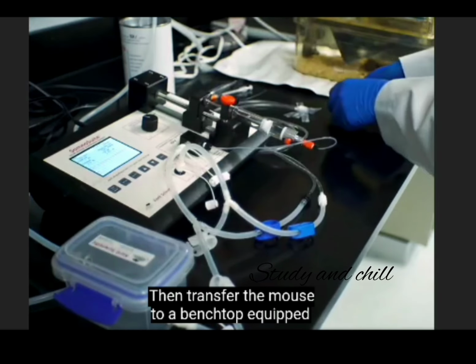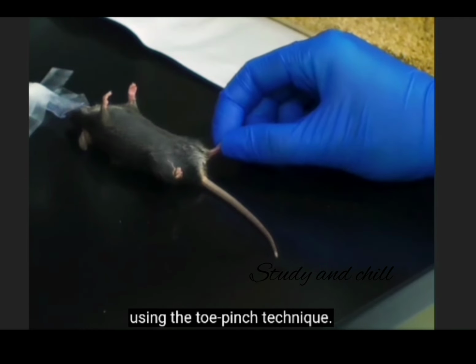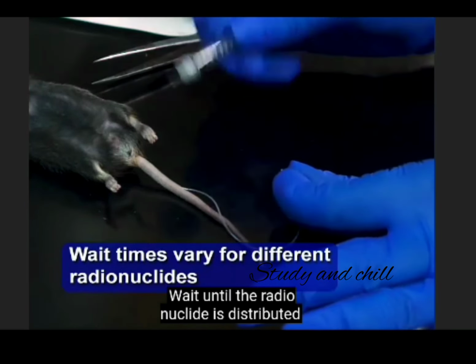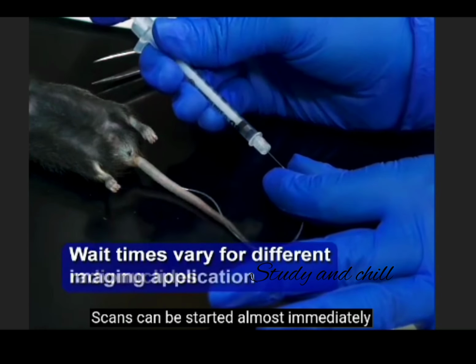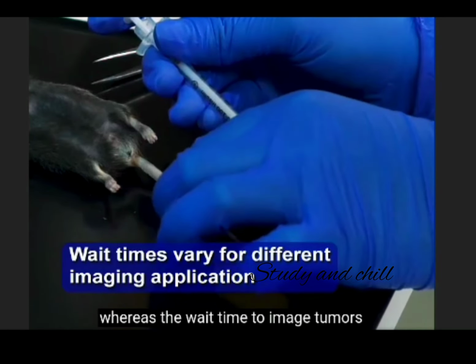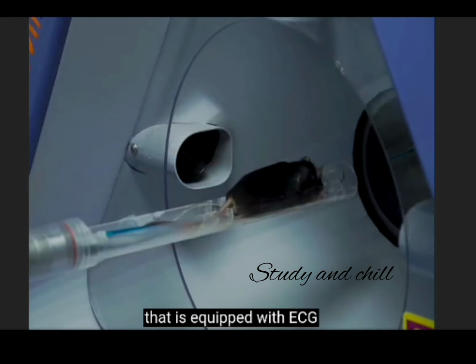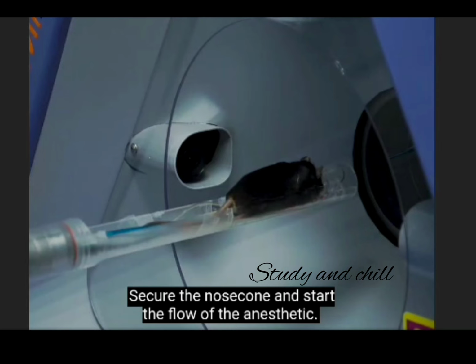Then inject the anesthetized mouse with the radionuclide technetium-99m. Wait until the radionuclide is distributed in the bloodstream and starts decaying. Scans can be started almost immediately for cardiology applications, whereas the wait time to image tumors may be several hours to days. Next, place the mouse on the SPECT CT stage bed that is equipped with ECG and respiration monitoring sensors. Secure the nose cone and start the flow of the anesthetic. Turn on the mouse bed heater and monitor the mouse's physiological parameters using the sensors and the device's internal camera.